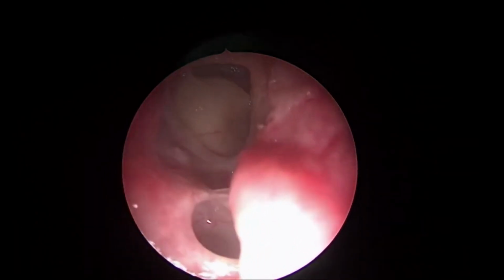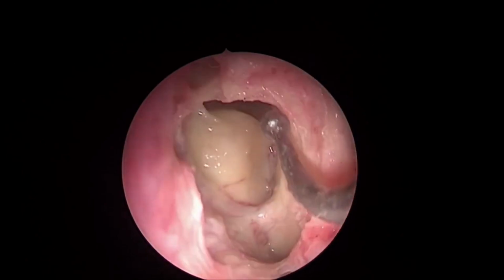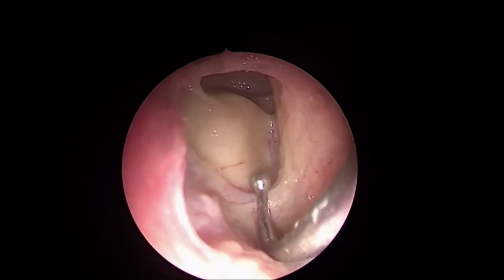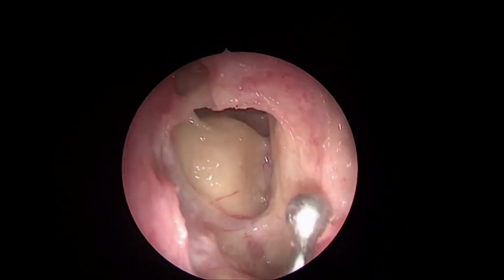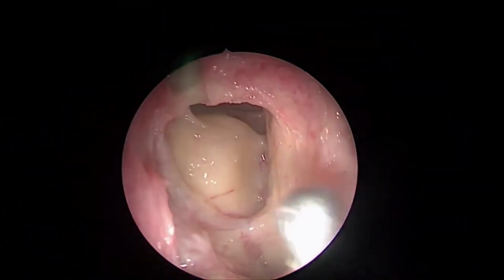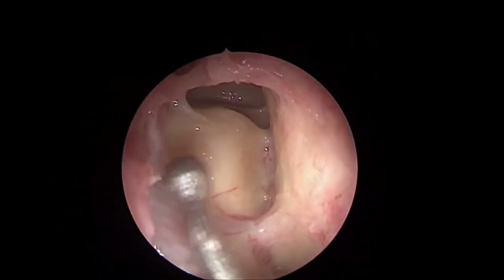So we should be very, very careful in working in the frontal recess, and like you can see here, preserve mucosa like Professor Prabhakaran said. This microdebrider is a mucosa preserving tool. It cuts sharp, it doesn't pull. We can use through biting, sharp instruments, microdebrider, all these help in preserving the mucosa rather than peeling them off.